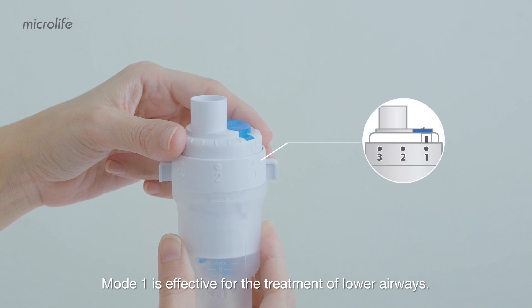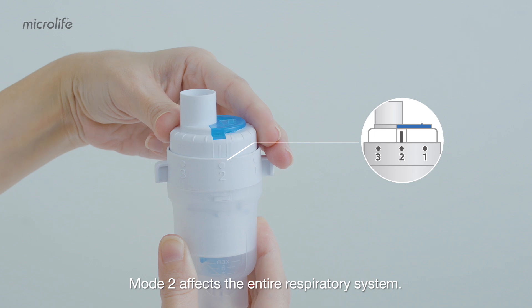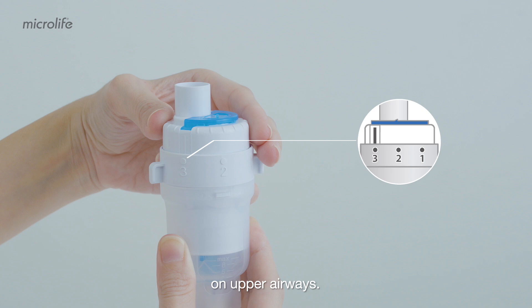Turn the nebulizer cap to set the therapeutic mode. Mode 1 is effective for the treatment of lower airways. Mode 2 affects the entire respiratory system. Turn on Mode 3 to maximize therapeutic effects on upper airways.